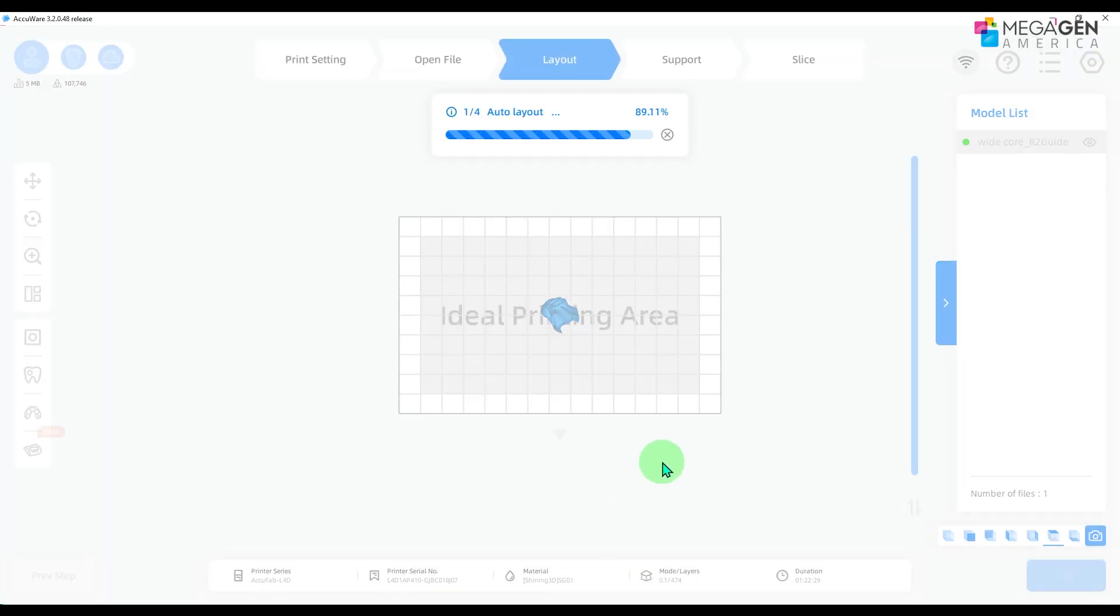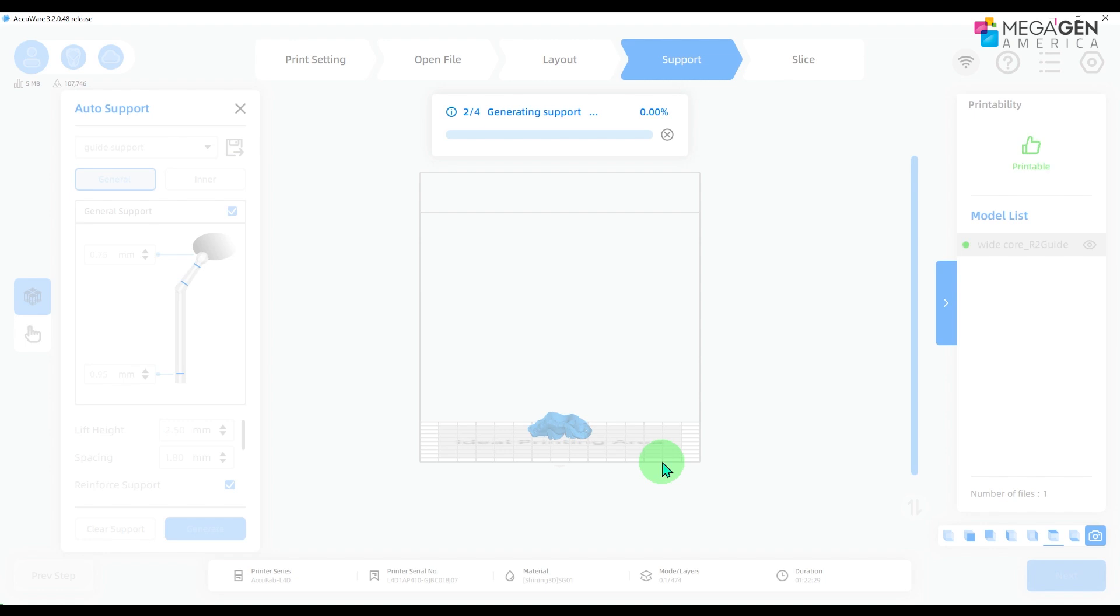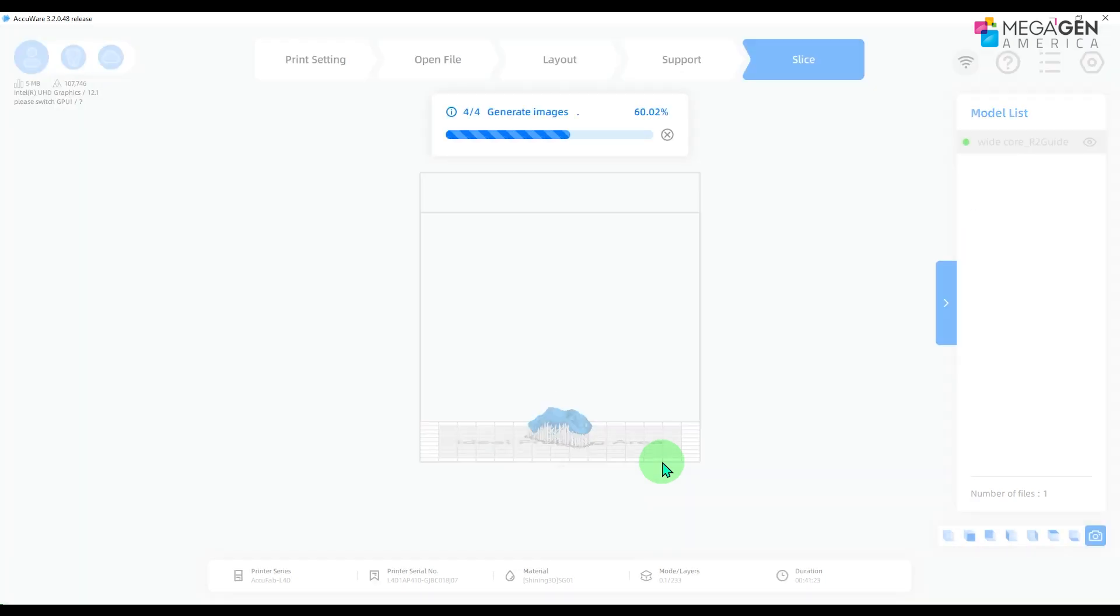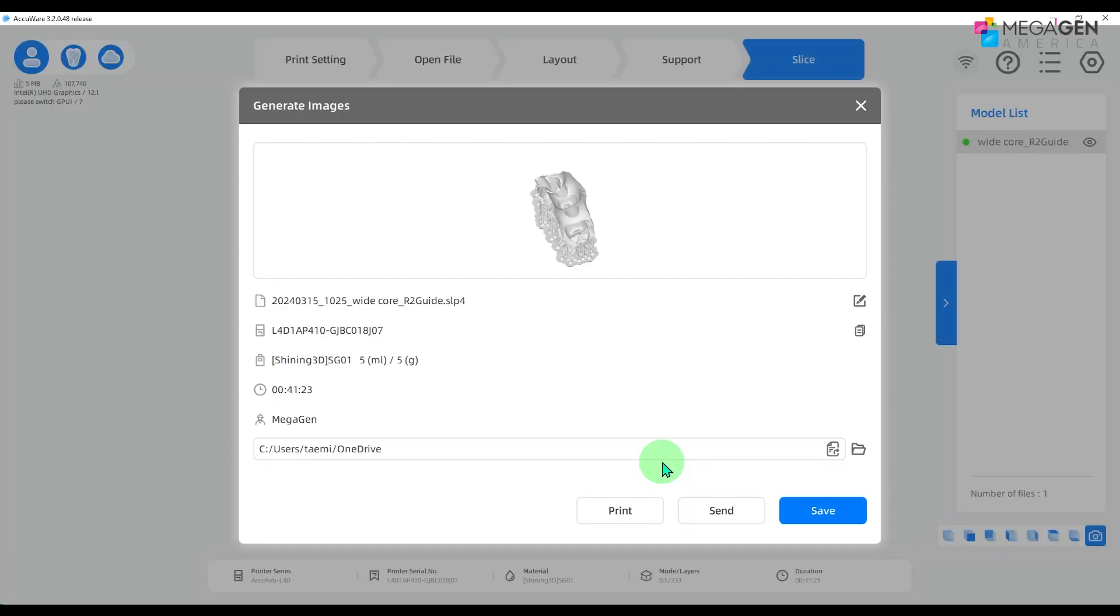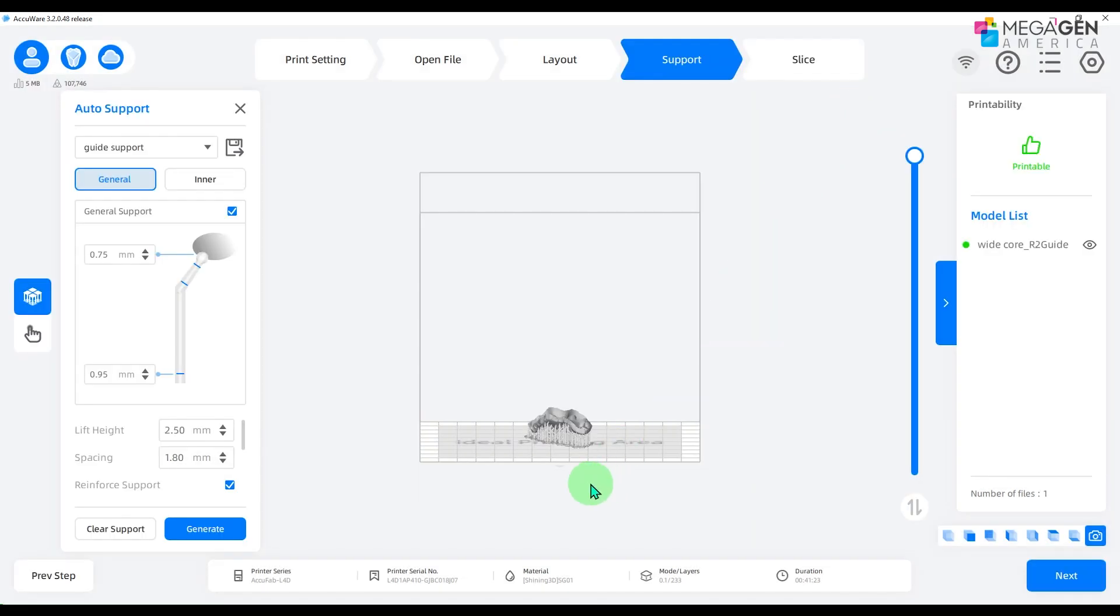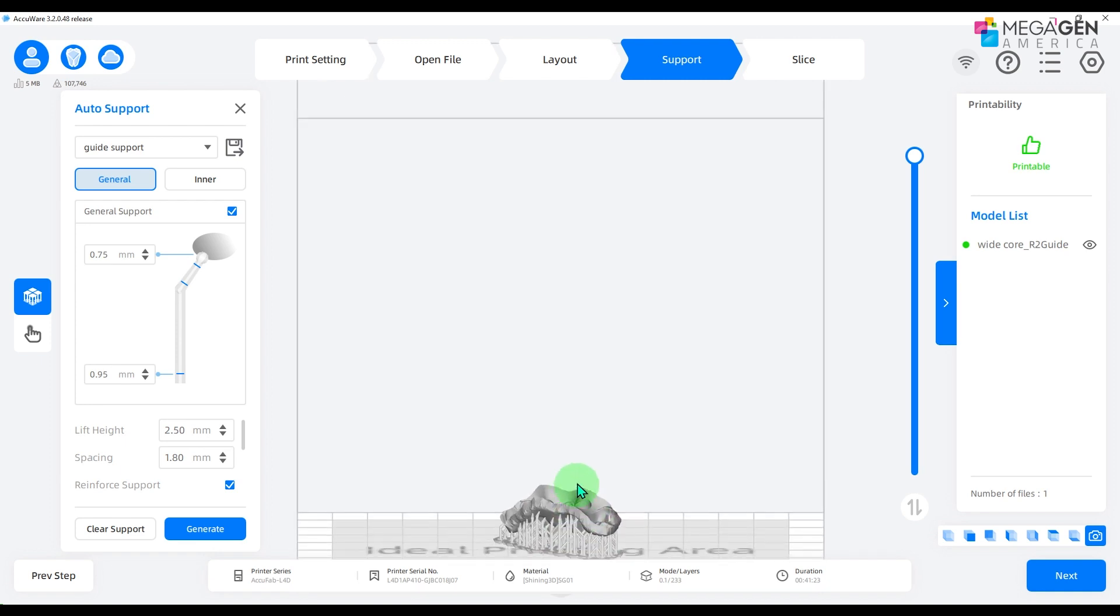However, the support may not be in the most optimal position. So I recommend editing the supports before printing. Go back to the support tab. Click on the finger icon on the very left to edit the supports.